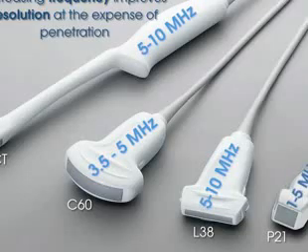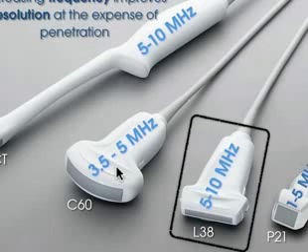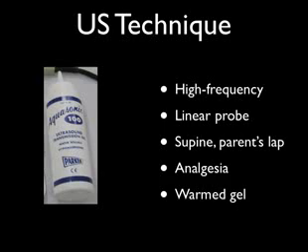Which probe do you think we're going to use? Well, normally when we look in the abdomen on adults, we have to use this probe here, but on kids, we actually get to use this probe here, my favorite probe, because it's got such high frequency and makes such pretty images. Now, one of the techniques that you want to use whenever you work with kids, of course, is the high frequency linear probe with the patient in the parent's lap. Lie the patient supine as best you can. It actually helps to bend their knees a little bit too.